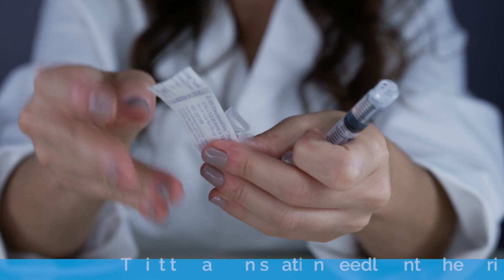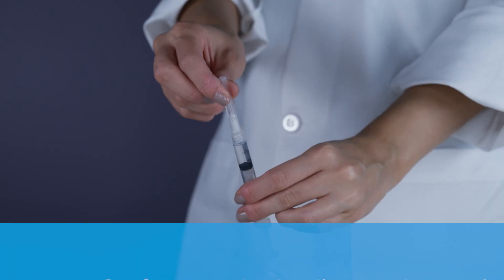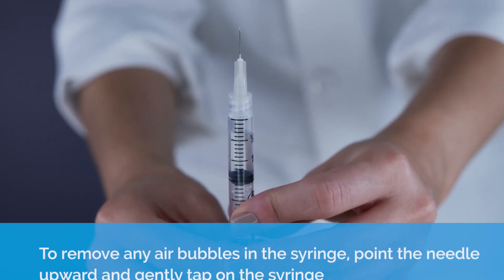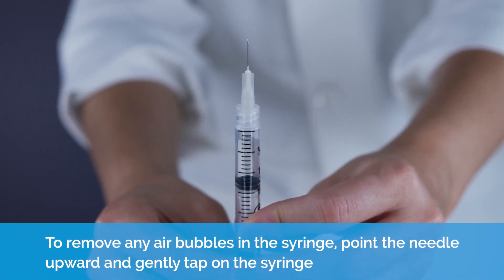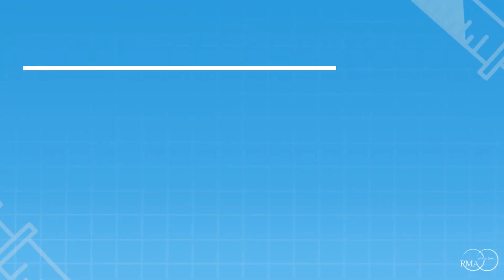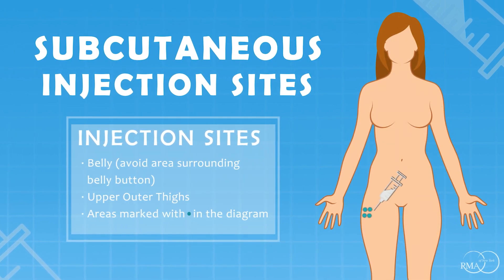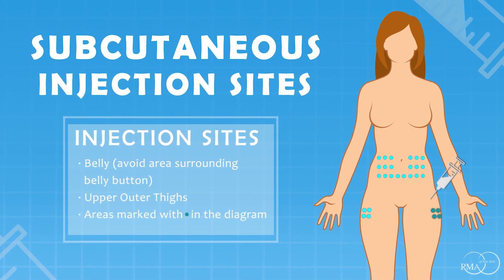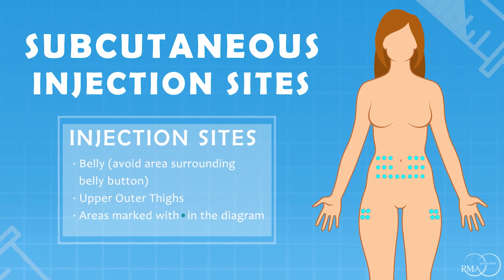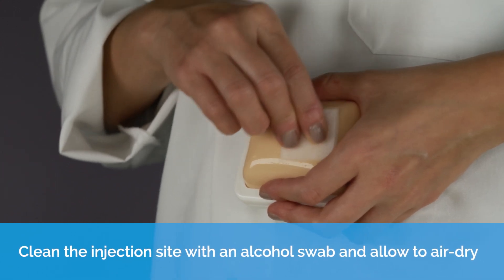Subcutaneous injection. Twist the administration needle onto the syringe. Remove any air bubbles in the syringe, point the needle upward and gently tap on the syringe. Clean the injection site with an alcohol swab and allow to air dry.